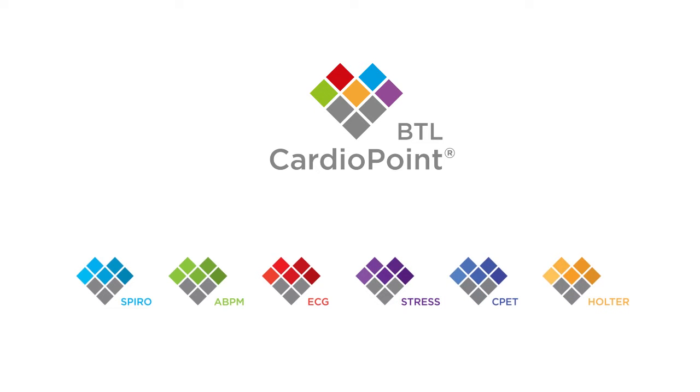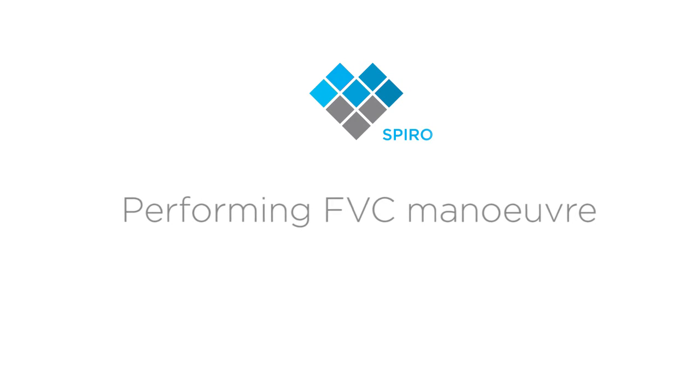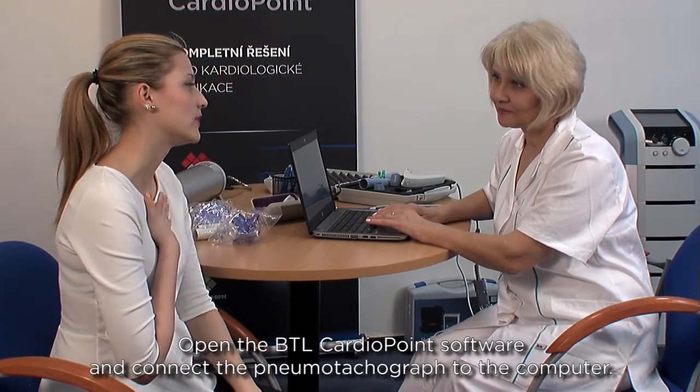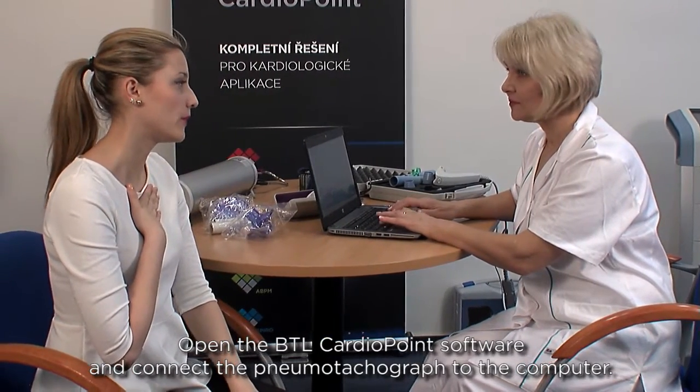This video demonstrates how to properly perform the spirometric force vital capacity manoeuvre with the BTL CardioPoint system. First, open the BTL CardioPoint software and connect the pneumo-tachograph to the computer.